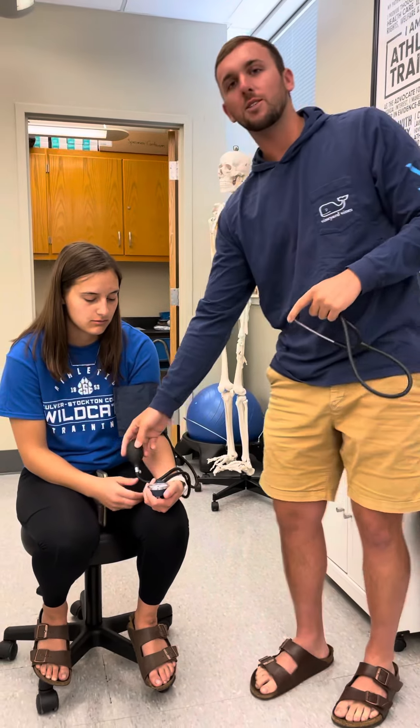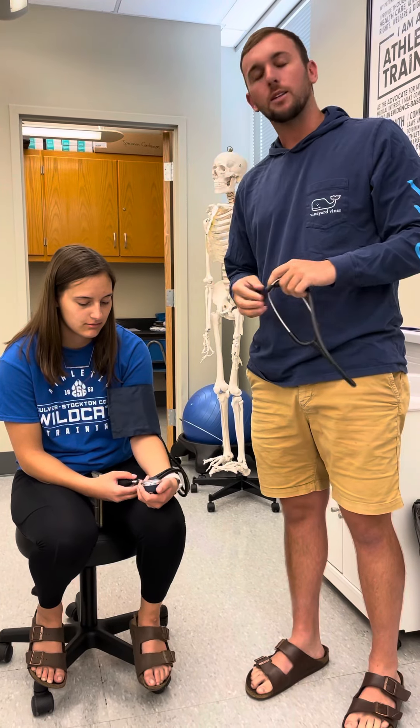Her blood pressure is 112 over 73, and that is all for the video.